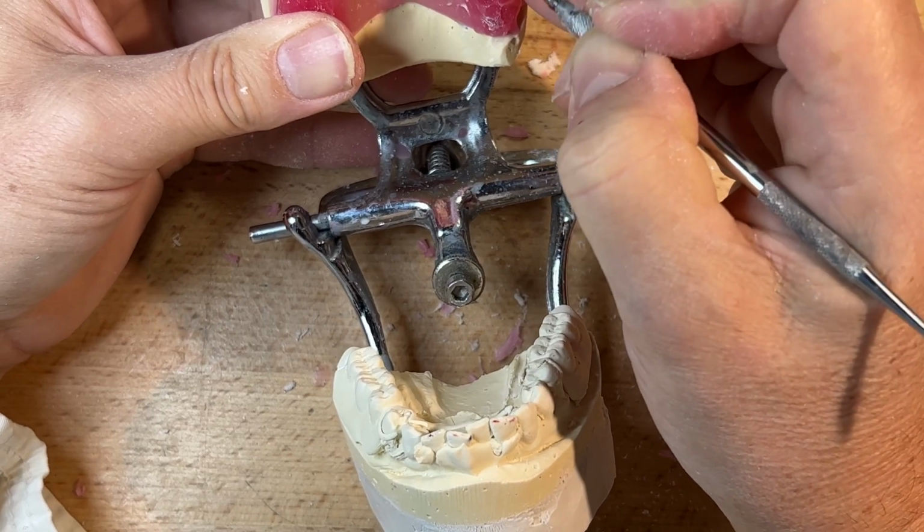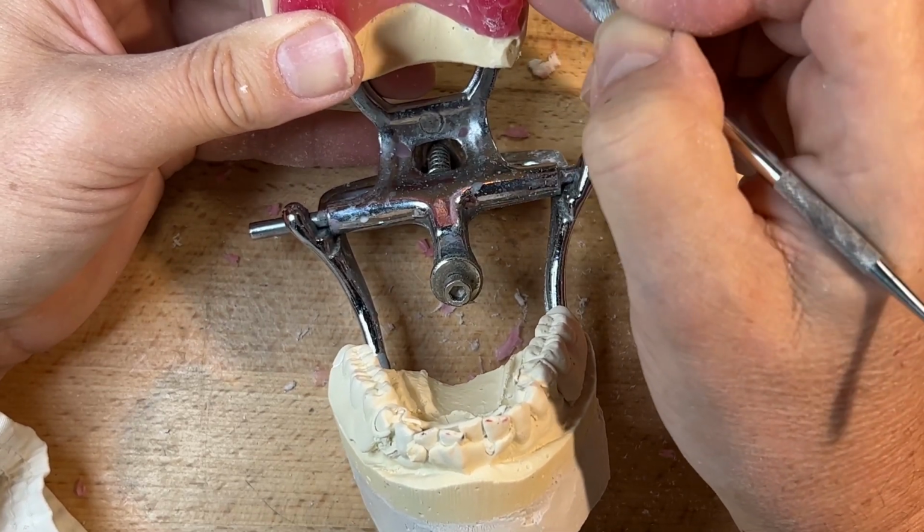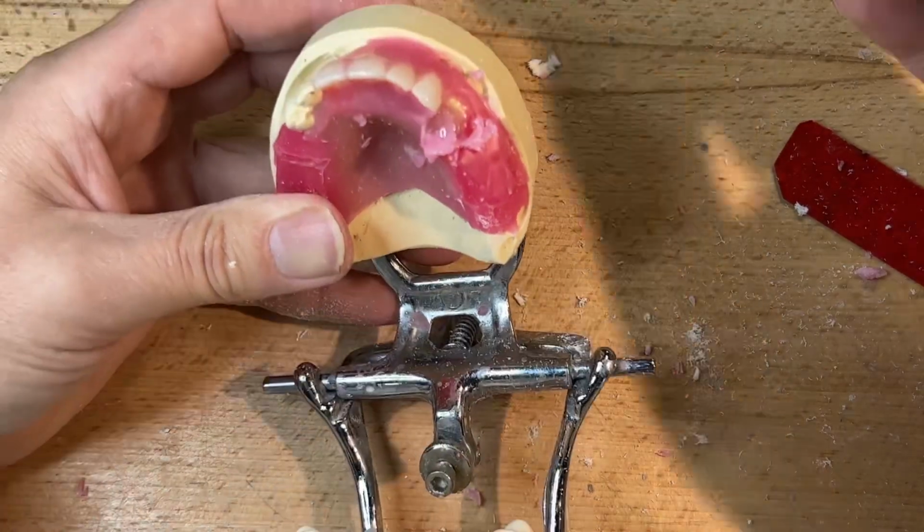Now, as you can see, I got a little bit of base plate here, but I'm still going to have the neck emerging from the ridge, as you can see, that I've exposed here.